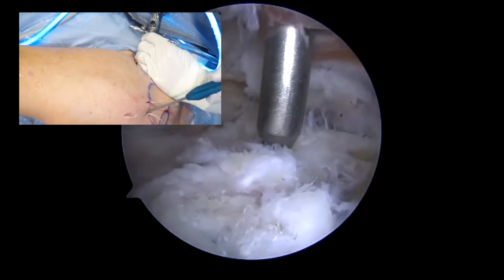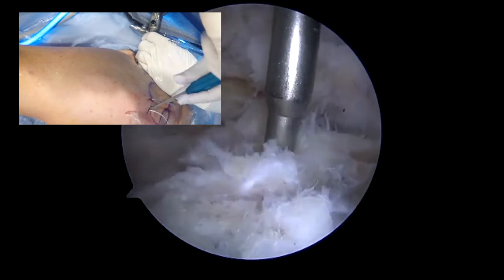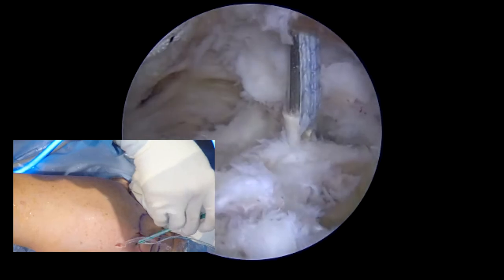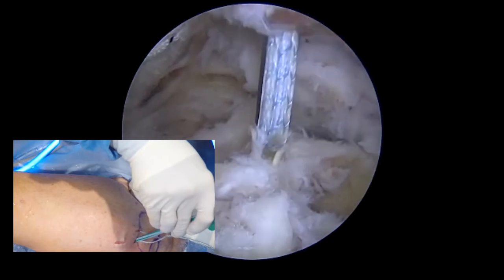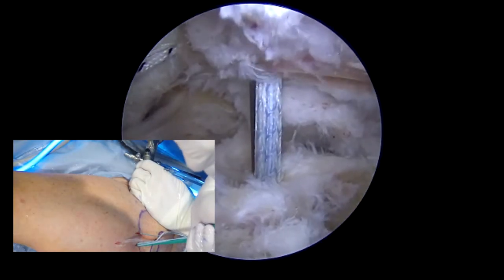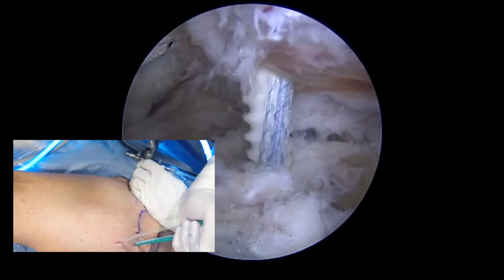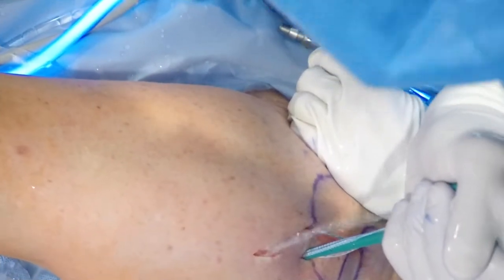This is the tap that's inserted up to the wider portion. We will now locate that previously drilled hole, again being careful to avoid the cavity which is more lateral from a previous anchor from prior surgery. This is done through a more superior lateral portal, and as we turn the swivel lock anchor, we can determine if there is sufficient purchase in bone. That anchor sufficed.